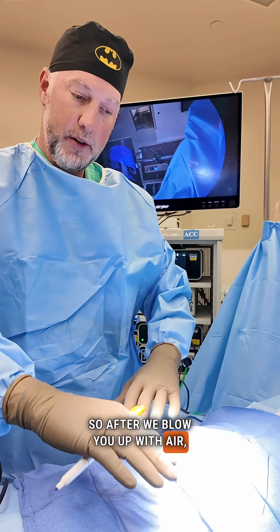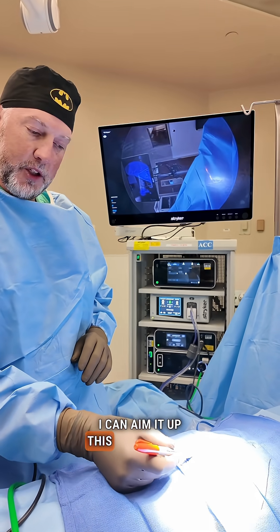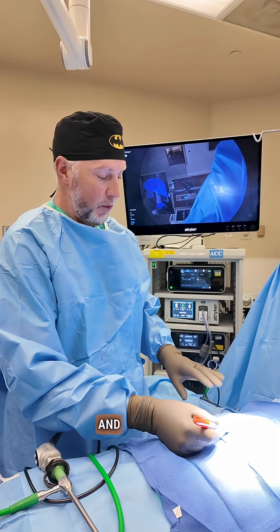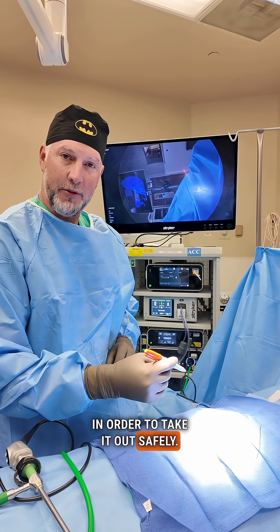After we blow you up with air, your belly kind of sticks out, and when we put that camera in I can aim it up this way towards the right upper side — and that's where we'll find your gallbladder. We'll push it up to the side and be able to find the structures we need in order to take it out safely.